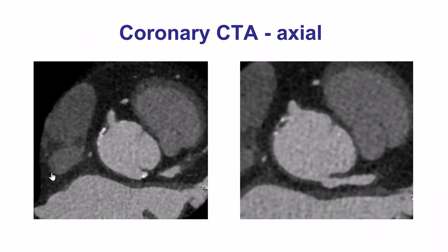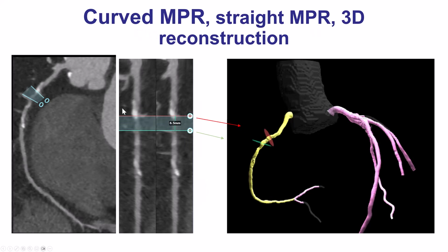The patient underwent coronary CT, which is very often done in our patients who undergo CTO PCI to plan the procedure, and showed that the RCA is coming at the expected location at 11 o'clock. And then there is a heavily calcified proximal cap.